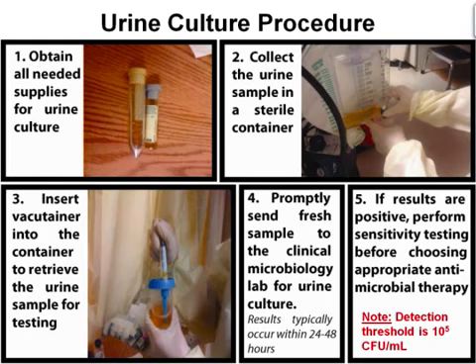If the result is in fact positive, according to step 5, sensitivity testing, like in blood culture, should be performed in order to decide appropriate antimicrobial therapy.